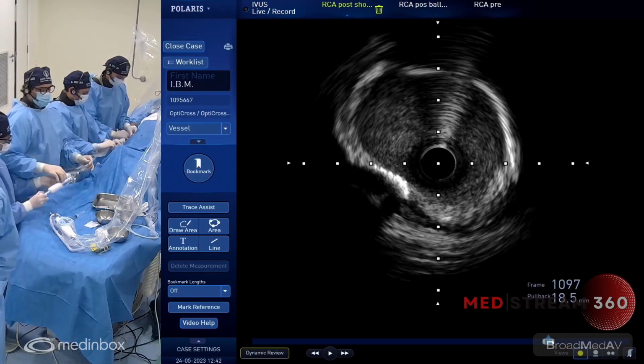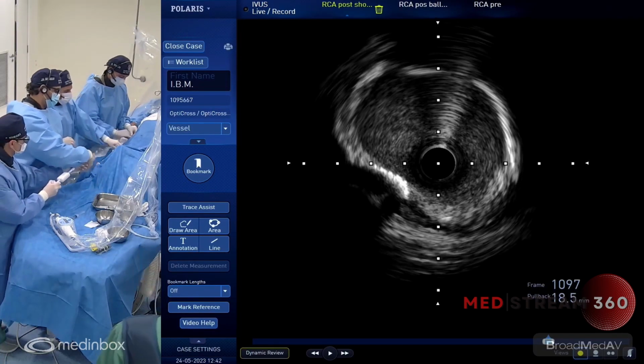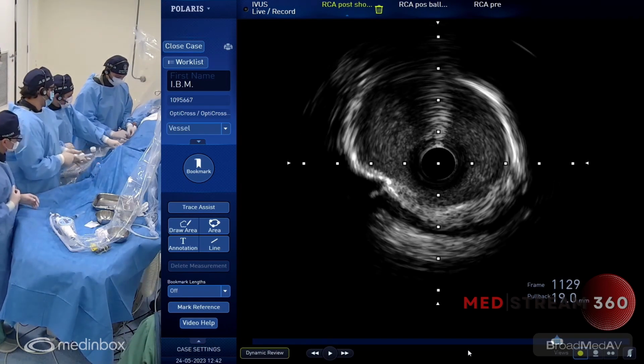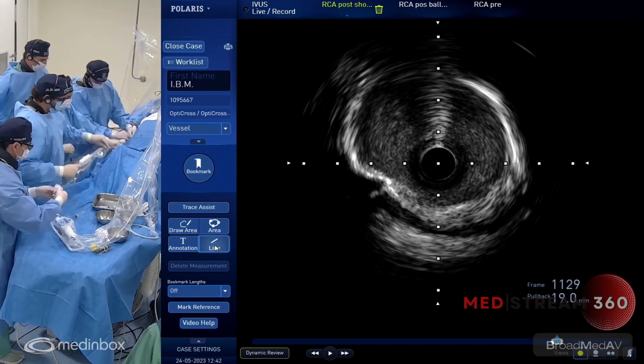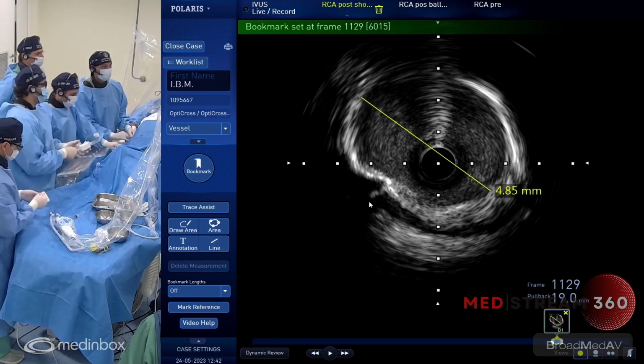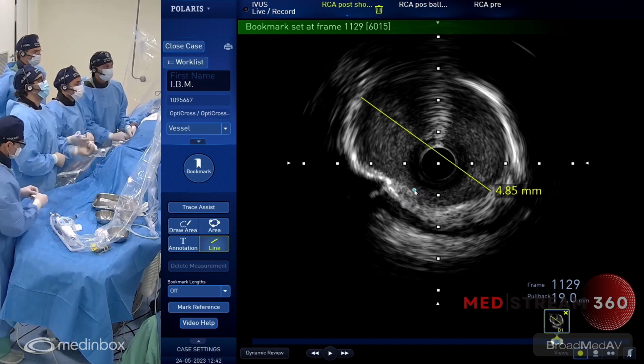4.0. So Rodolfo is working hard. Why don't you come with a stent right now? Is there any explanation for this? Why do you choose a balloon? Because when I tried to recross with the IVL balloon, it did not cross.